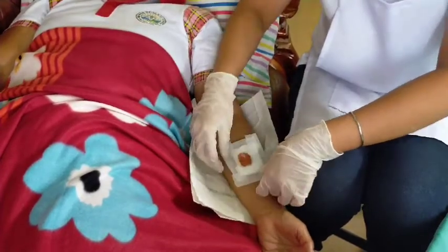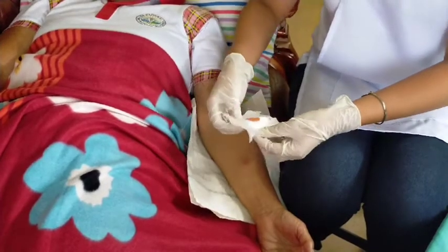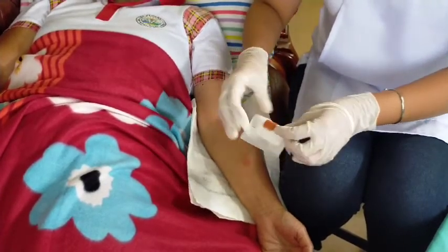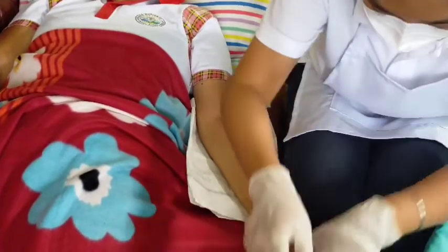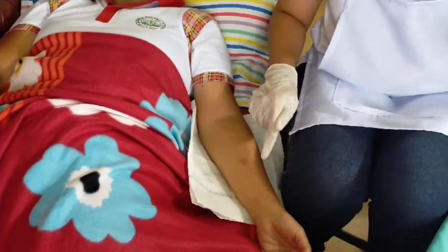Next, we're going to carefully remove the soiled dressing. So if there is resistance, we can also use a silicone-based adhesive remover to help remove the tape. And if any part of the dressing sticks to the underlying skin, we can also use small amounts of sterile saline to help loosen and remove it.